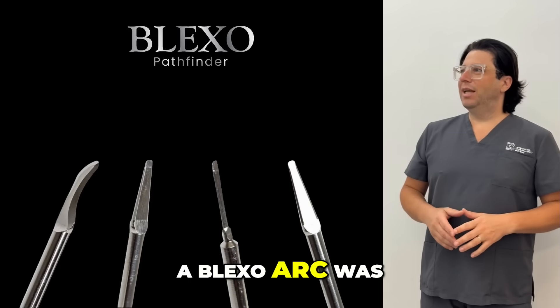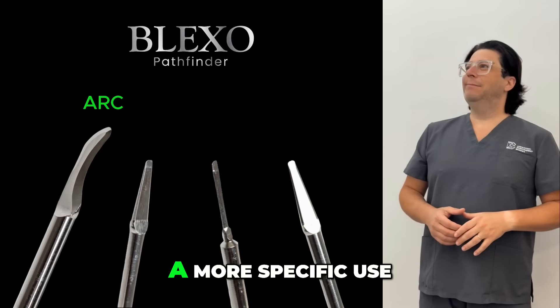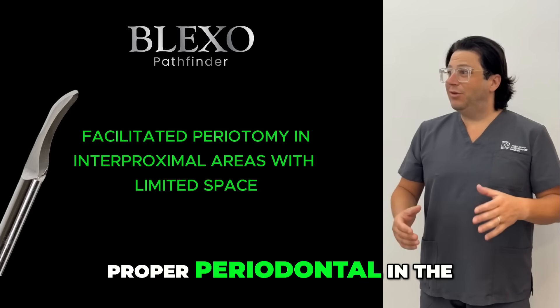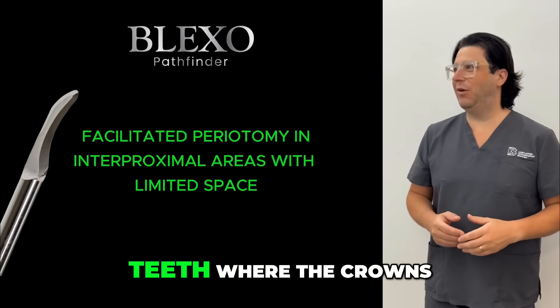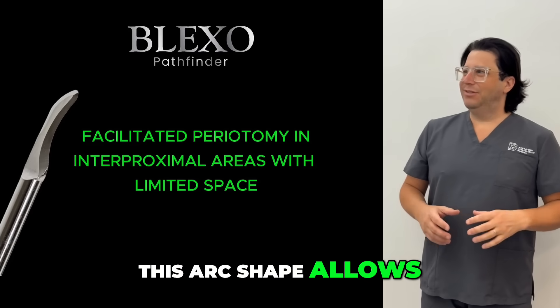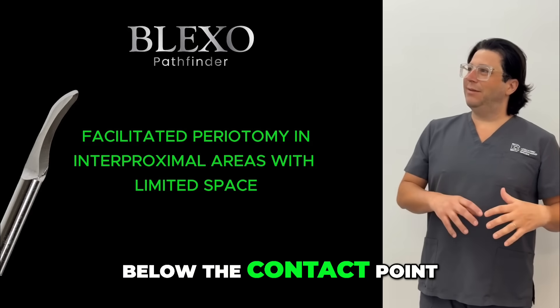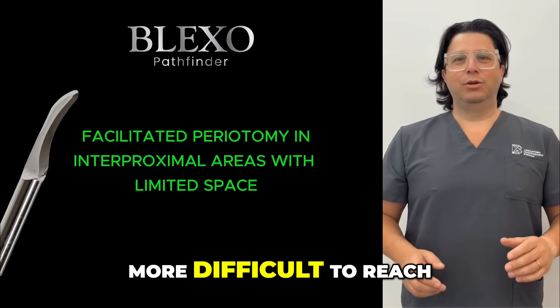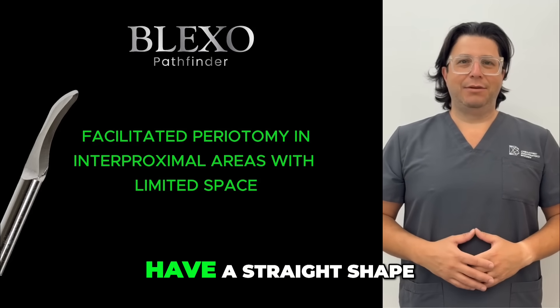A Blexo Arc was also created, which has a more specific use: to perform proper periodotomy in the interproximal area of teeth where the crowns are still present. This arc shape allows the tip of the instrument to be brought below the contact point and to work in an area that is more difficult to reach with traditional straight instruments.